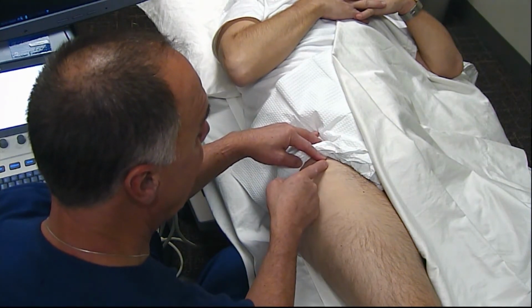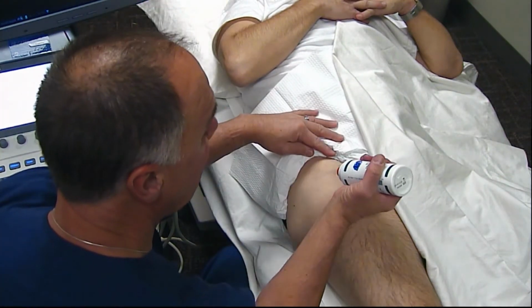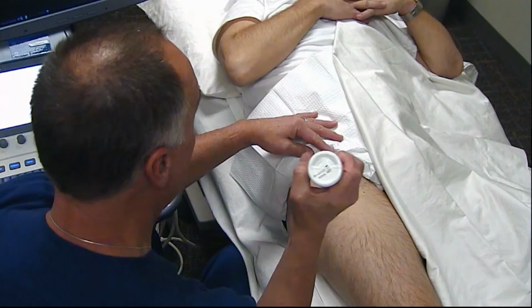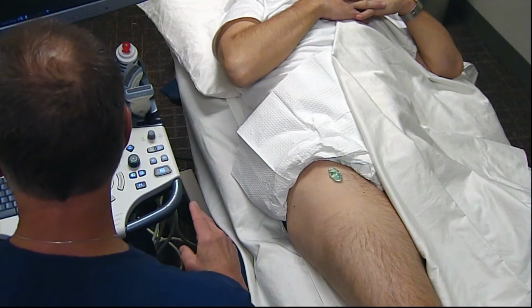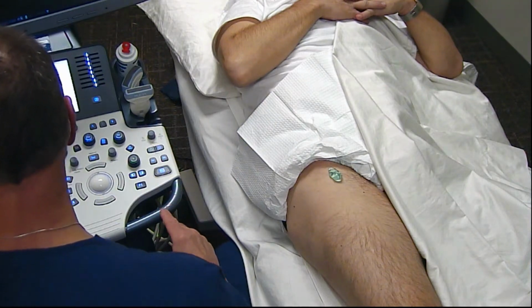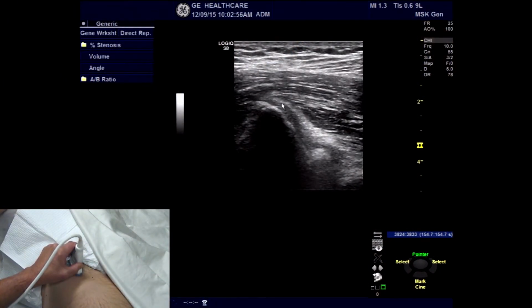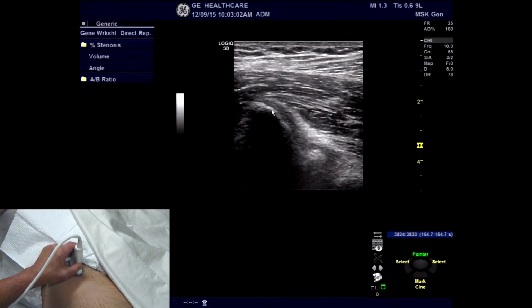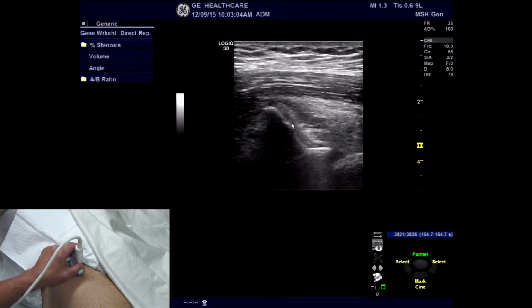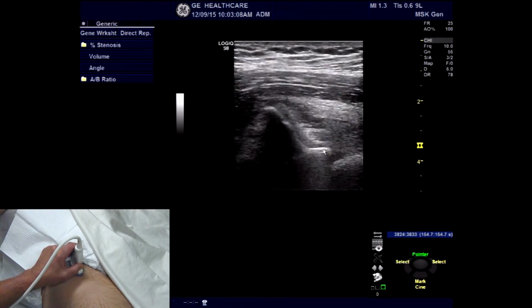So after palpation of the bone landmark, I'm going to use either a curved linear or linear array, depending on the patient's body habitus. And in this situation, I'm going to start out with a linear array transducer. Beginning with placing the transducer on the skin in a long axis fashion, we'll see the ilium or the bone landmark here. Then we're going to follow it down to the acetabulum, which is this ridge-like structure.